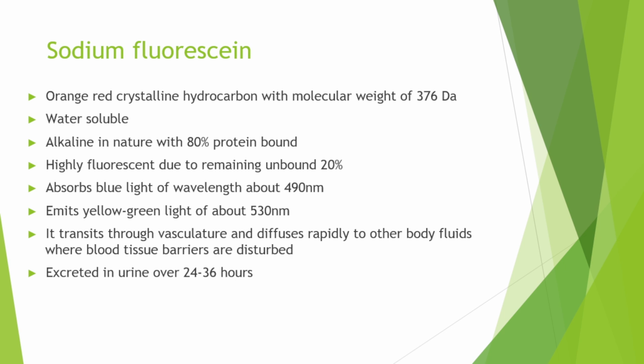Coming to the sodium fluorescein molecule, which is the dye used in FFA, it is an orange-red crystalline hydrocarbon with a molecular weight of 376 Dalton. It is water-soluble in nature and alkaline. 80% of it is protein-bound, mainly to albumin, and the remaining 20%, which is unbound, is responsible for the fluorescence.